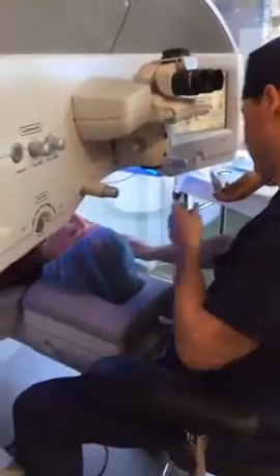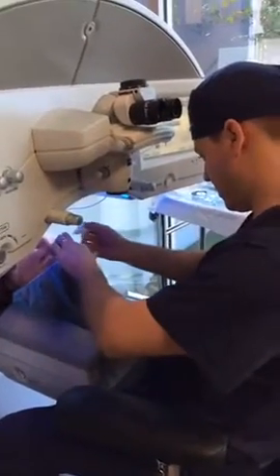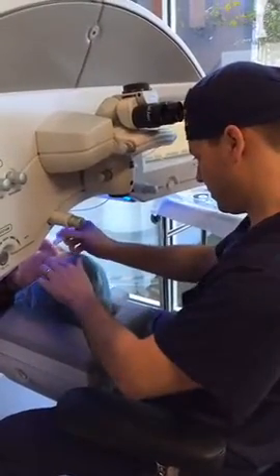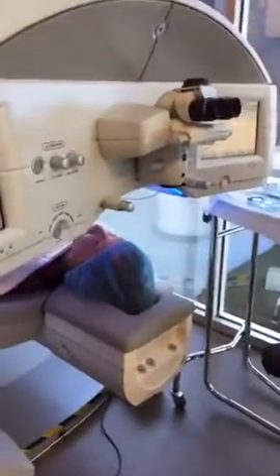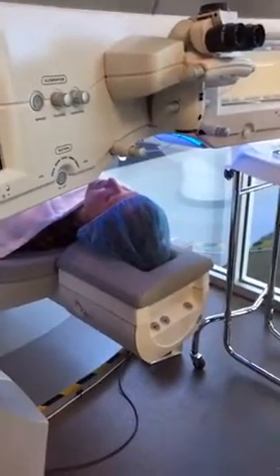Alright guys, I am in the surgical suite with Halee and Dr. Parkhurst. Bear with me, I'm working with two phones here, so we'll make it happen. And I want to show you guys everything that we've got going on here with Halee Edwards, live LASIK. That kind of blue dome sky I was telling you about in the other room. And this is another anesthetic drop for you. How's the light show down there, Halee?